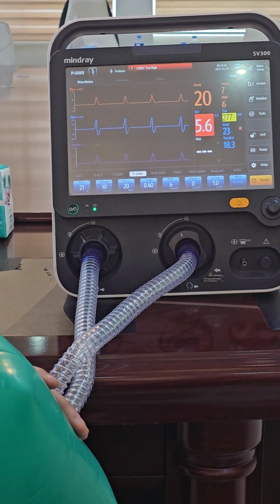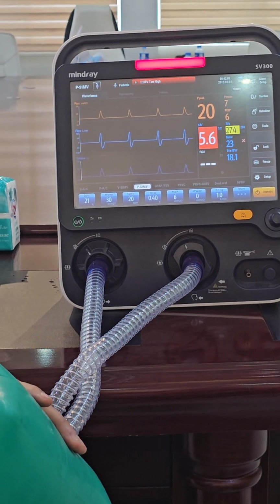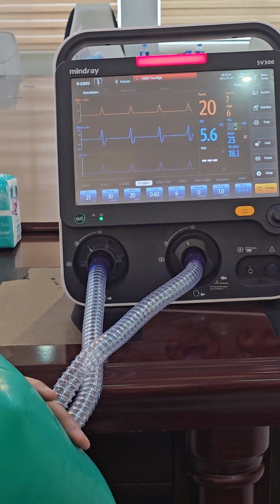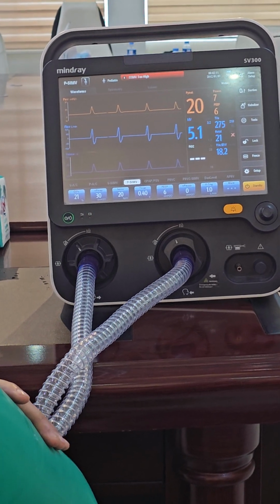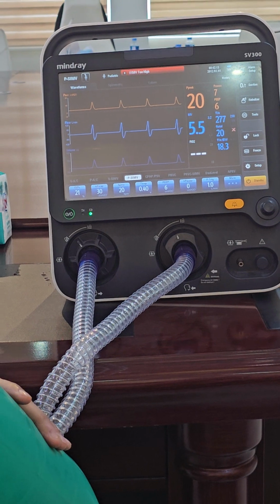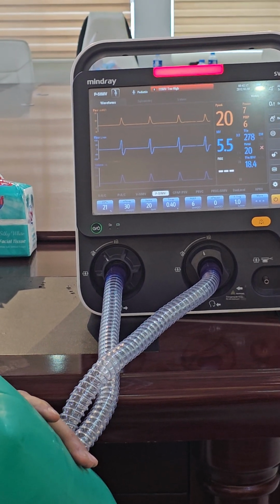Yes. So it's flow control, while in the first two modes, it's a time control. We tell the machine that when you support, give it within this time. You understand? In PSV, no. It will be support, but it will give open time for the patient to do it.